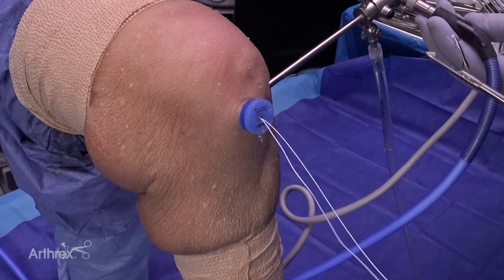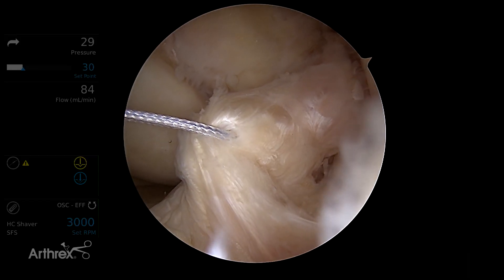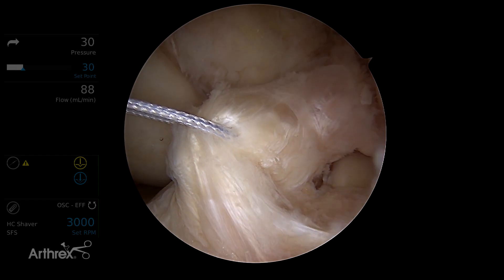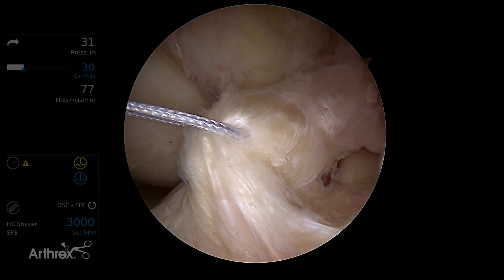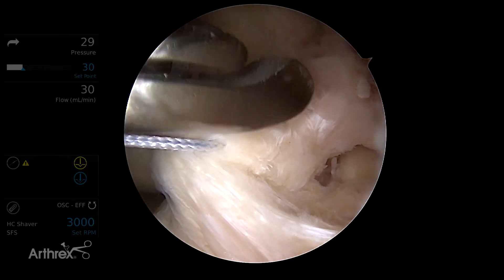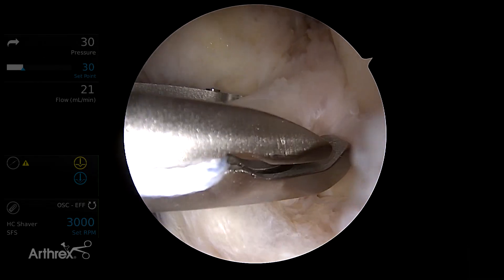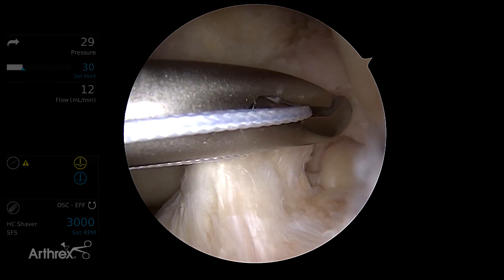One of the things you don't want to do is pull too hard on the ACL. You can see this one's nicely intact, but sometimes when you're repairing them the fibers are a little loose, and if you pull too hard you can pull them apart. We're going to come back in and stitch back and forth across the ligament, creating a Bunnell-type suture pattern.